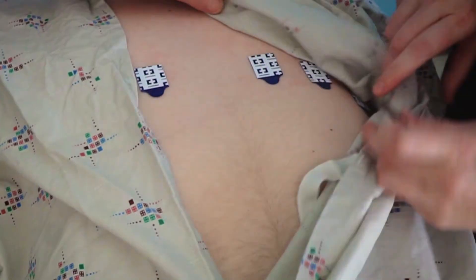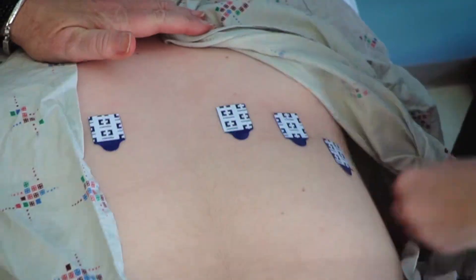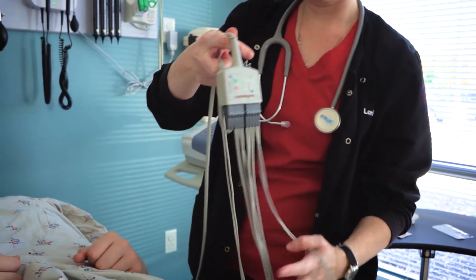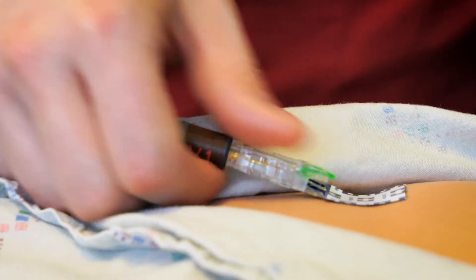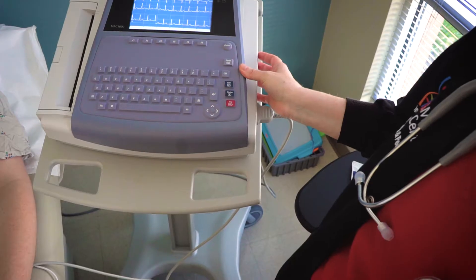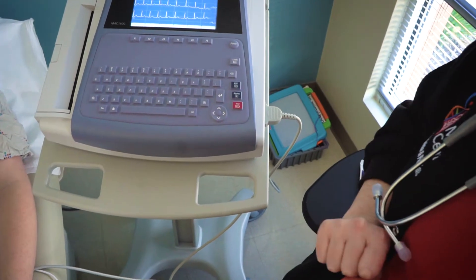The companion video will show patients how and where leads will be placed on their body. Have patients view this segment of the video prior to the appointment and practice placing a sticker on at home to help desensitize them to the process. Encourage the patient to ask questions and explore the leads and other items prior to the procedure. A quick demonstration of how the leads attach to the stickers is always helpful.